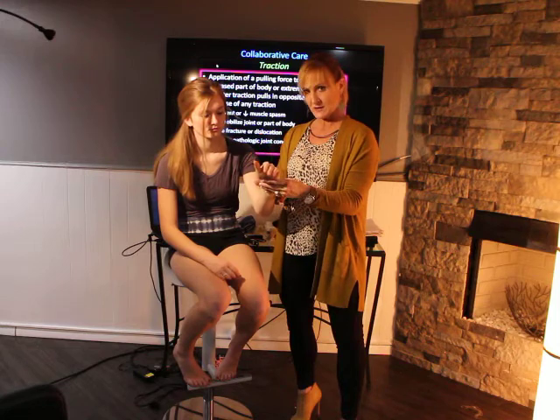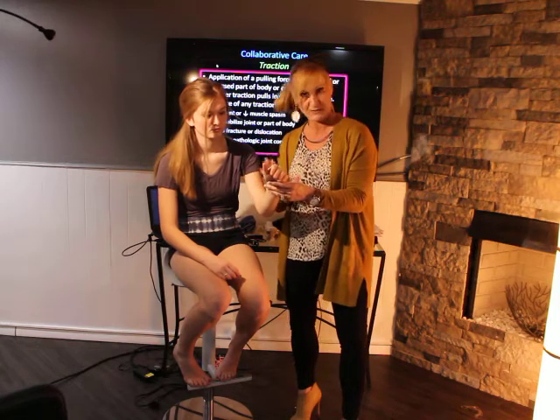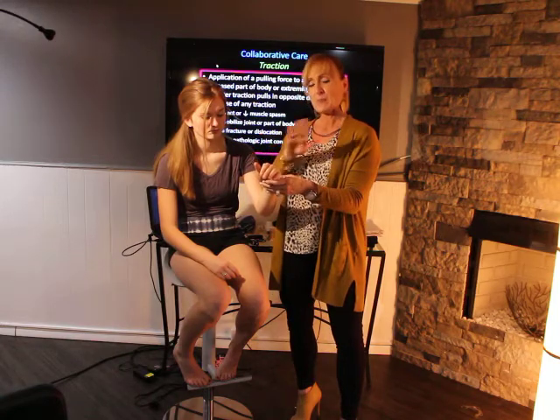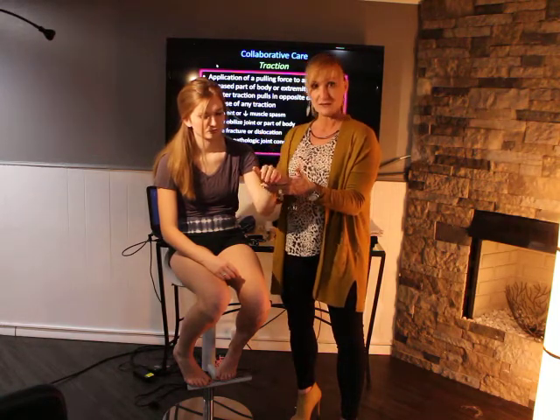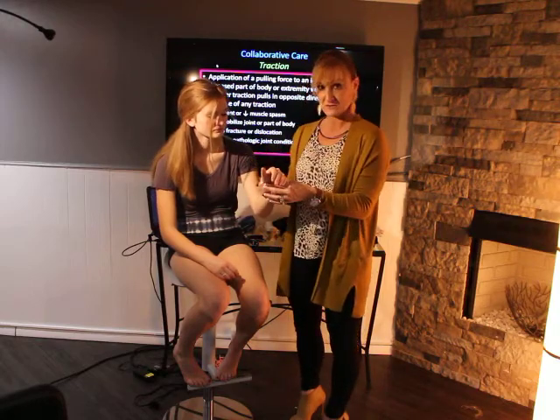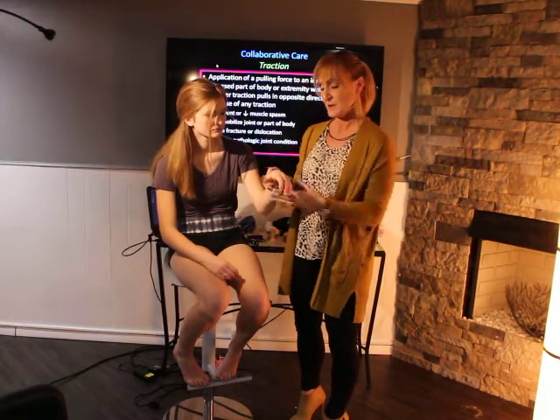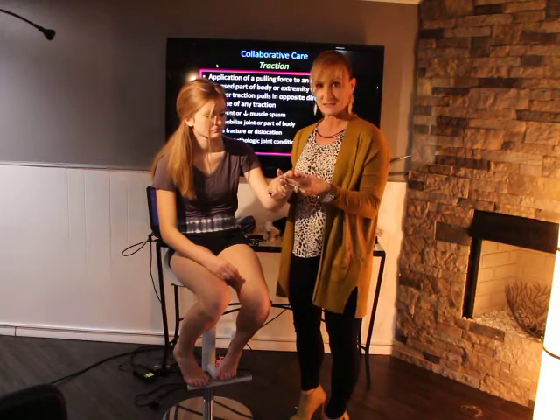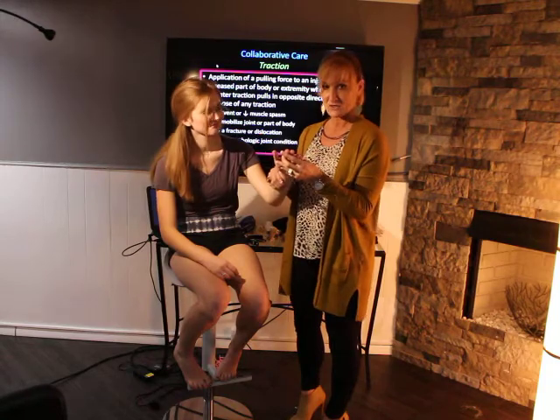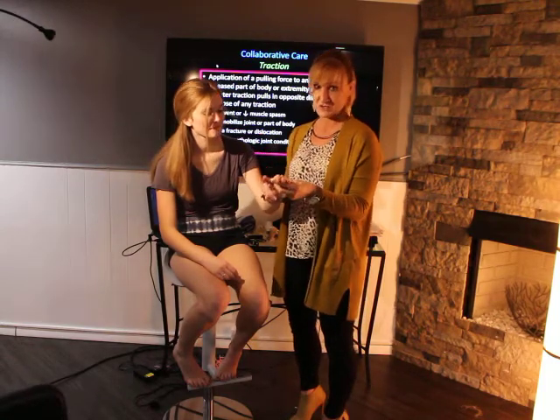So once you get an x-ray and confirm that you don't have a break involved, then you're going to treat that sprain with a splint or a brace. And you're going to want to do the RICE that we've talked about: the rest, ice, compress, elevate. But I want to show you how to apply some of these different braces, because if you apply it wrong, you can actually cause more damage to your patient. You don't want to do that.